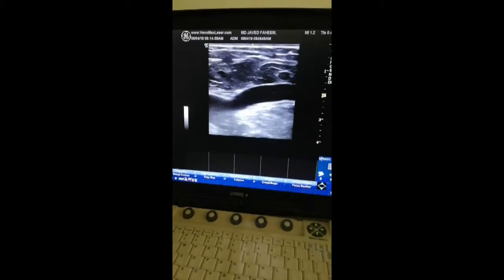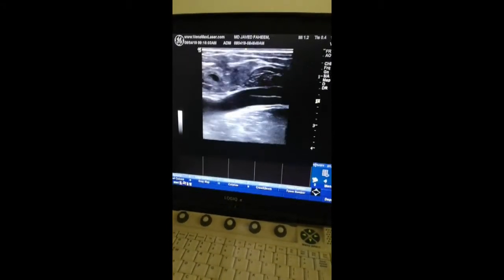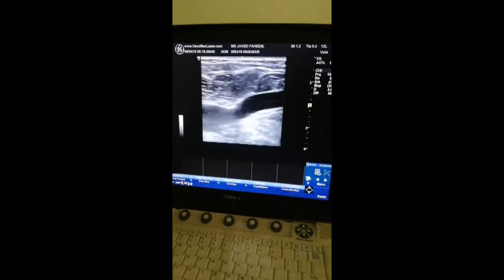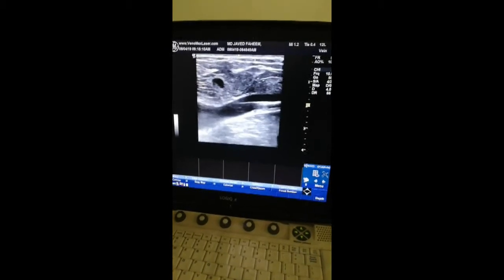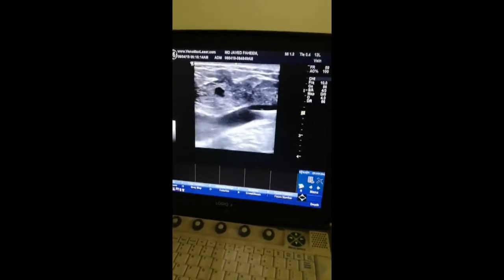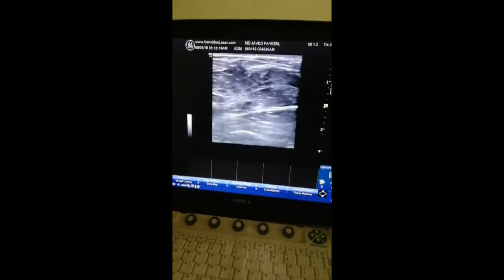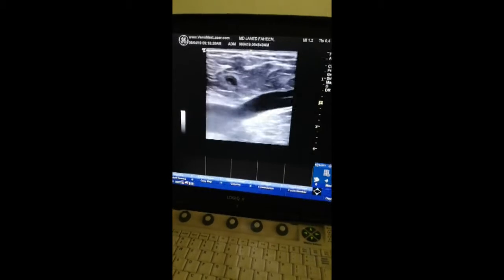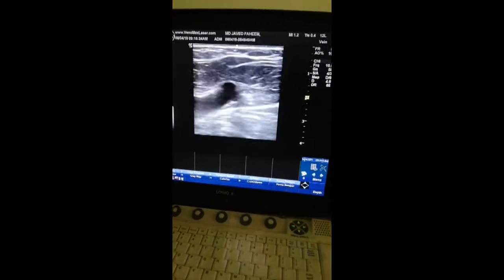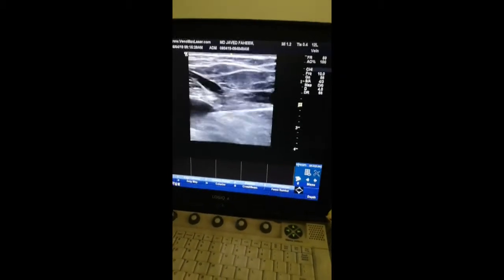It jumped in with a jerk and we are now pulling it back. We can now show the junction. We are trying to visualize the epigastric vein which is joining at the saphenofemoral junction. There it is — that is the epigastric vein.